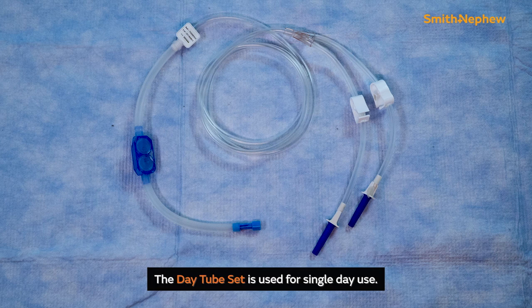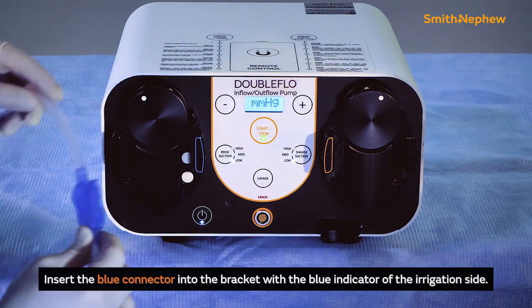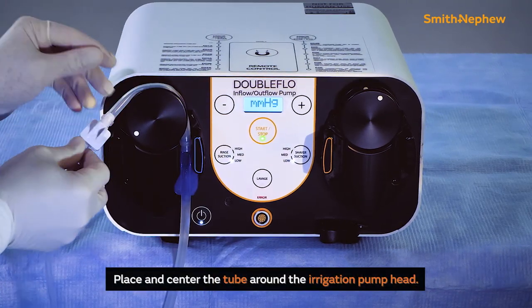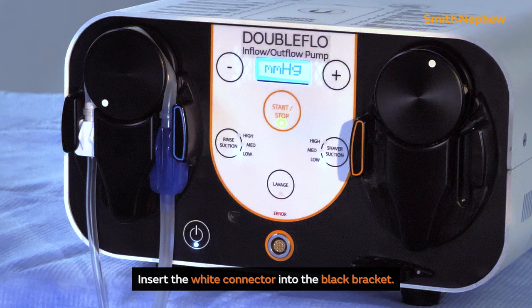The day tube set is used for single day use and delivers saline from the saline bags to the joint via the patient tube set. To install the day tube set, insert the blue connector into the bracket with the blue indicator of the irrigation side. Place and center the tube around the irrigation pump head. Pull the tube tight through the left opening of the black bracket for the irrigation side.